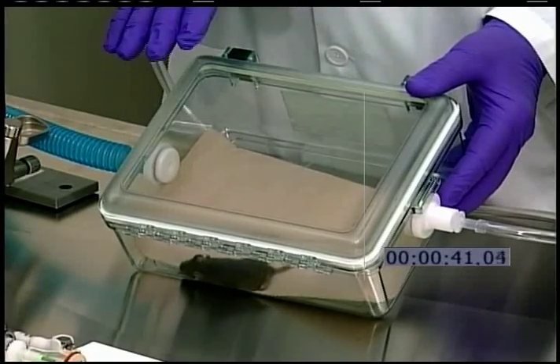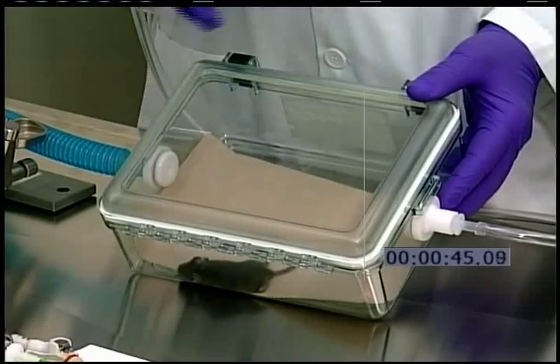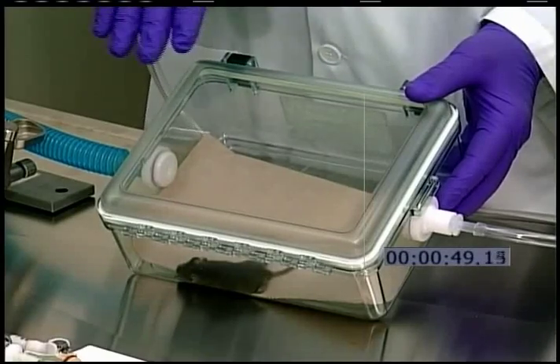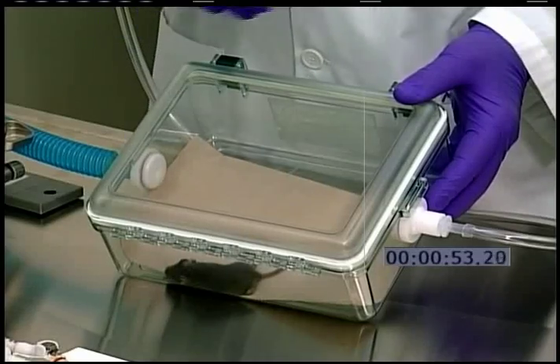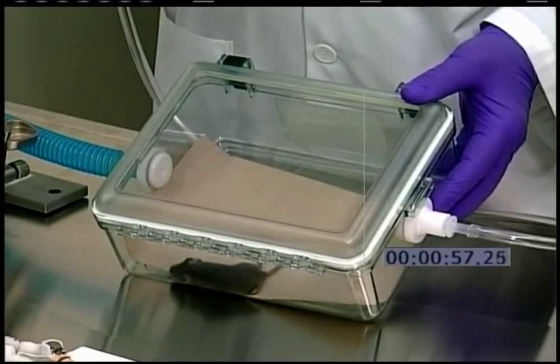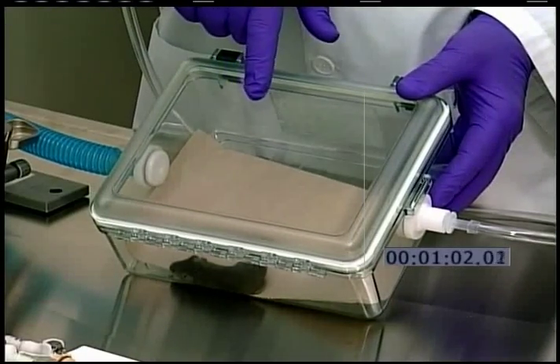It's important not to have any bedding materials in here. It's nice to have a little towel in there so that we can absorb the urine and the feces. It's nice not to have any other animals in here so that there's no cannibalism that's going on. Our oxygen flow rate is still at a liter per minute flow, and now you can see he's starting to move his tail.